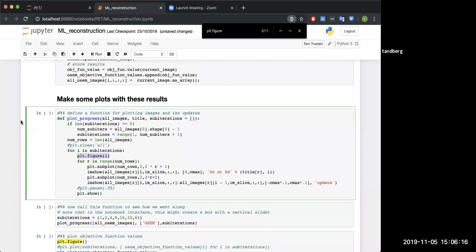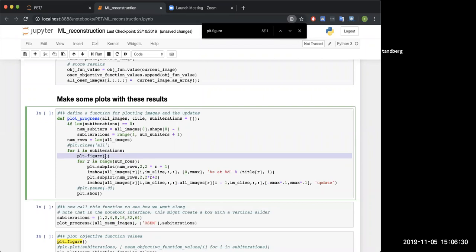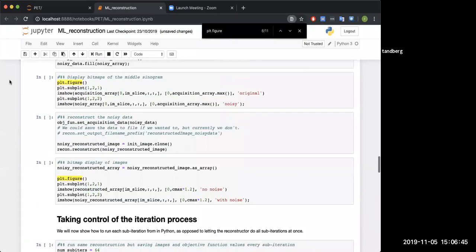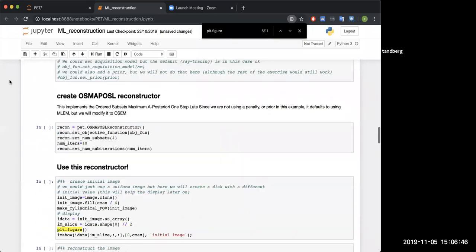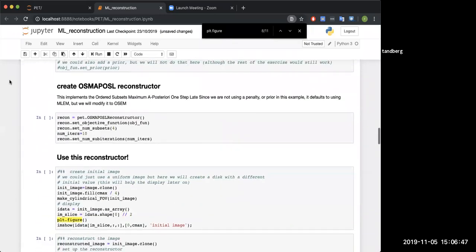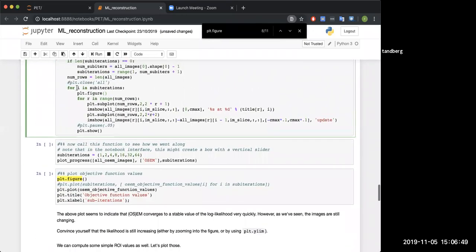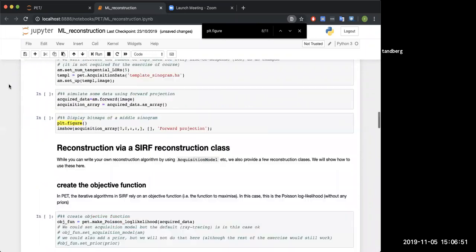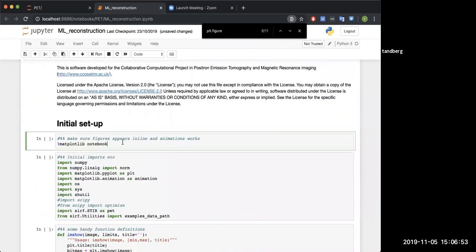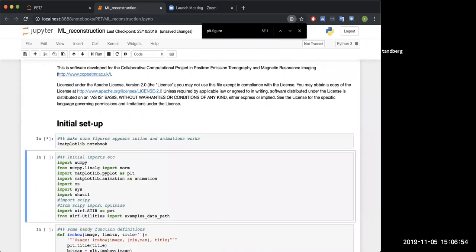Before we get into this ML reconstruction, would you all do me a favor? Could you go down to this bit of code that I've highlighted, so probably do a control F in your browser, go to 'make some plots with these results', and find this line where it says plot.figure i, and just take the i out. That's a little fun coding exercise for you. It's just to avoid accidentally plotting some things on top of each other.